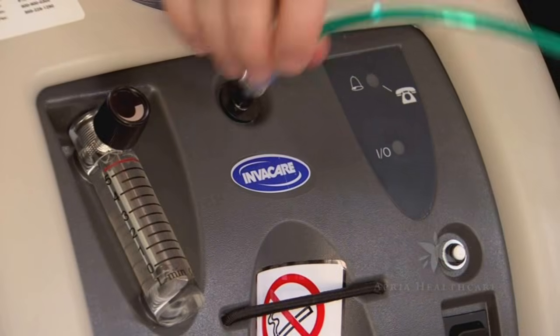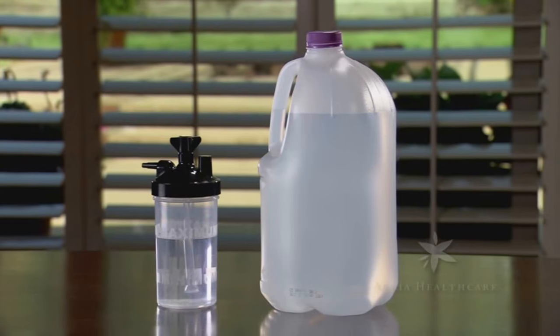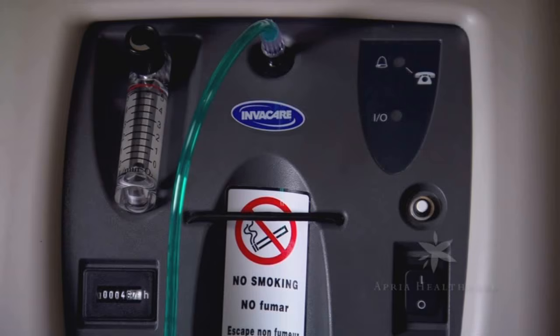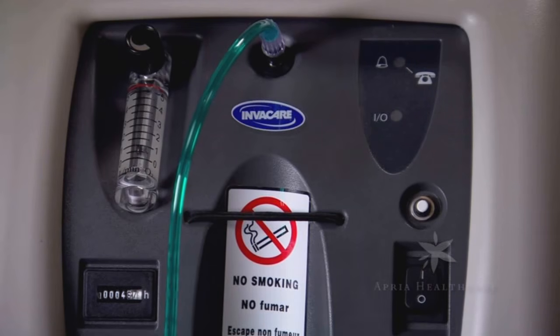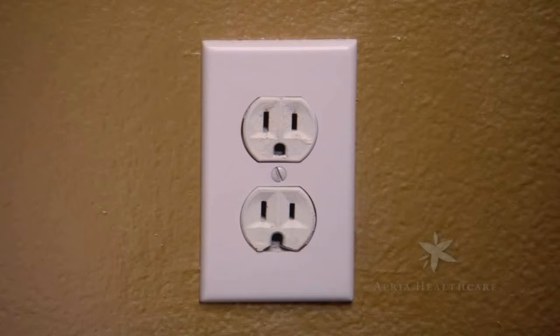An outlet where the tubing or cannula attaches is located close to the flow control. Most concentrators also have a place for a humidifier bottle if ordered. Many units also have indicator lights that show you if the unit is working correctly. On some models, an alarm indicates certain types of problems with the concentrator. The following step-by-step instructions will help you operate your concentrator.